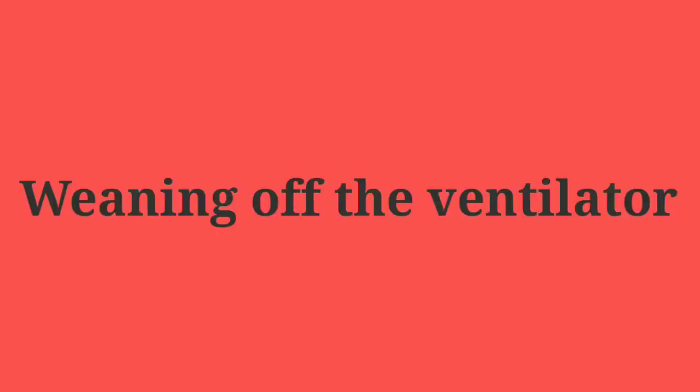That largely depends upon how your patient responds once the patient is on the mechanical ventilator. On average, these COVID-19 patients remain on the ventilator for a couple of weeks, and then if they are doing fine, we can switch it back. If there is no contraindication, these patients will need anticoagulation prophylaxis. We need to take very good care of their caloric requirement, because they may be in a negative nitrogen balance status.